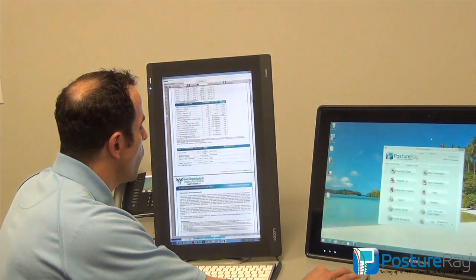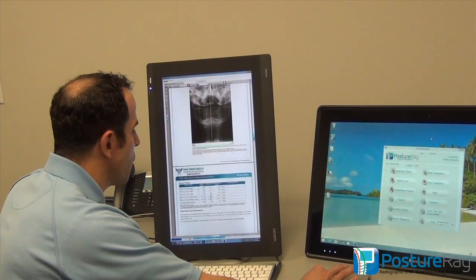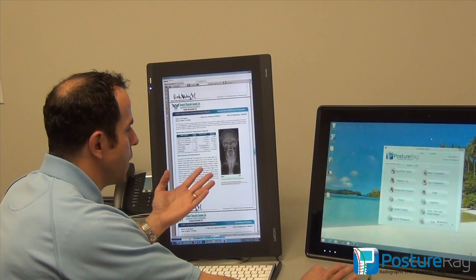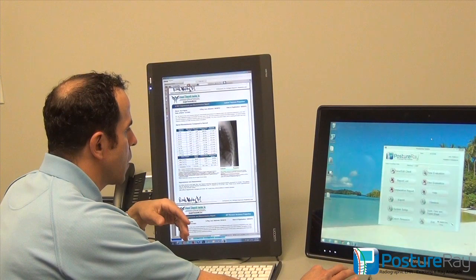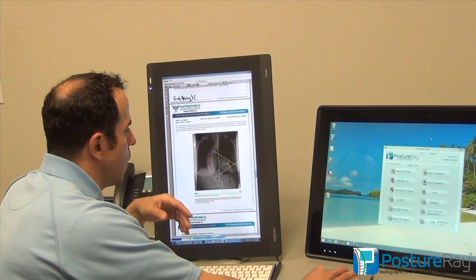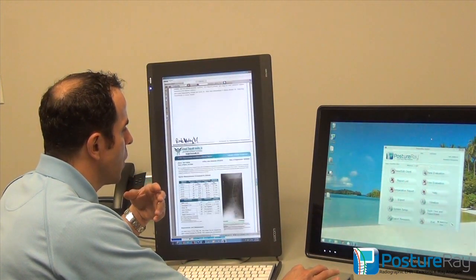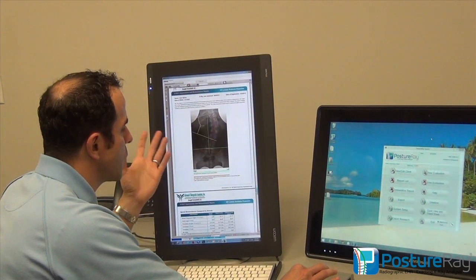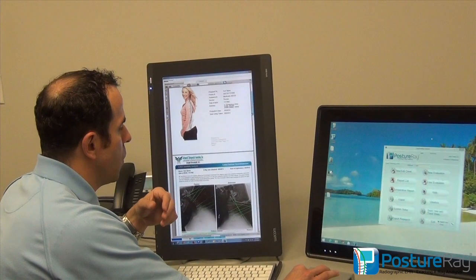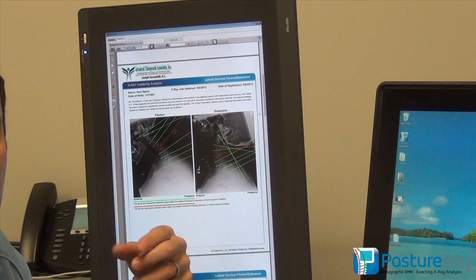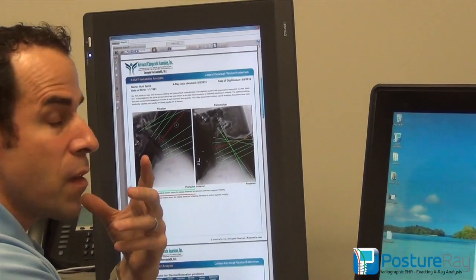Moving forward, we can document all of their x-ray findings — even scoliosis, AP open mouth, lower cervical, nasium findings, vertex base posterior, and the lateral thoracic with our model. We have a scoliosis example with Cobb lines and Riser-Ferguson. We also cover lateral lumbar. For med-legal work, if you have to document cervical spine injuries based on the AMA guides, we've got that covered too, using end plate lines originally pioneered by Panjabi. We also can do Penning's assessment — to my knowledge, no other system is even able to do Penning's assessment, let alone a traditional PACS.